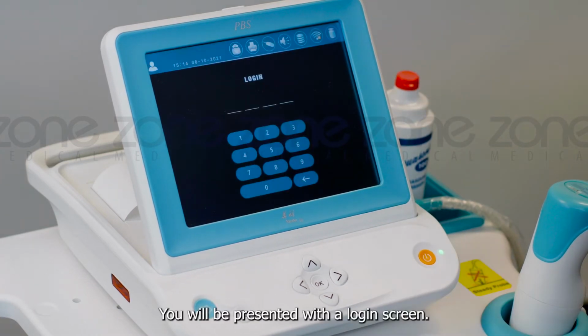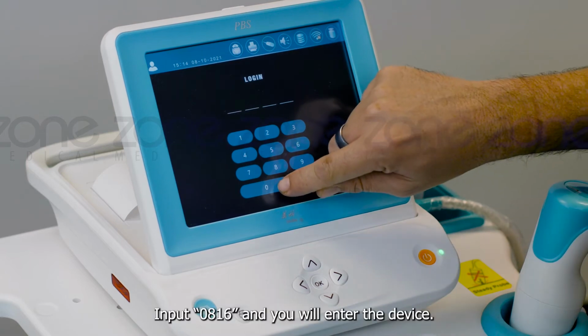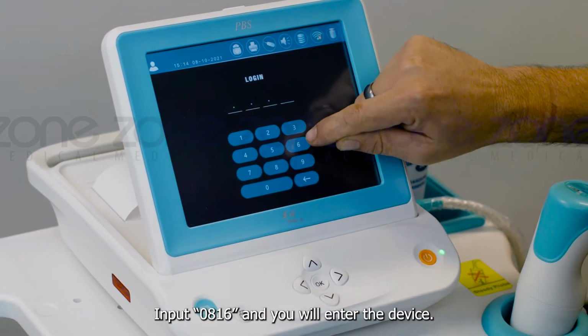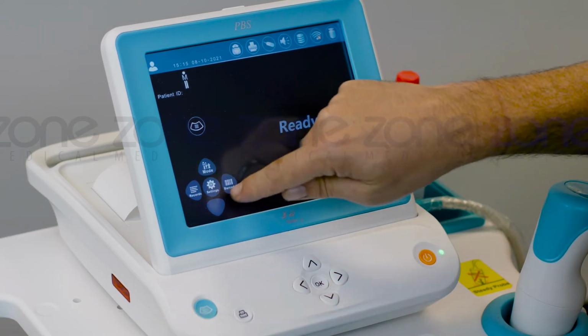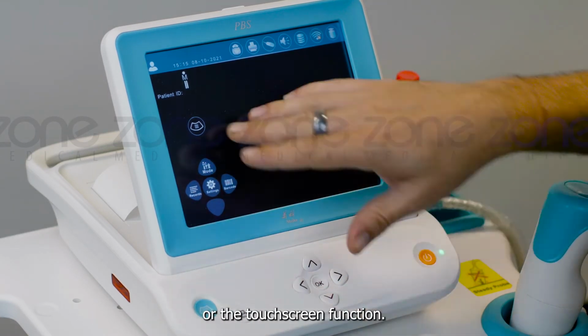You will be presented with a login screen. Input 0816 and you will enter the device. The buttons on the Meike reflect what is seen on screen. You can use either the physical buttons or the touchscreen function.